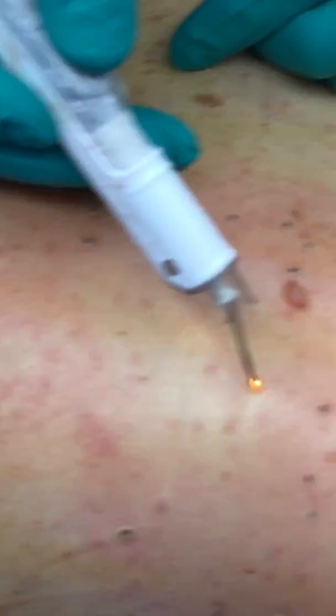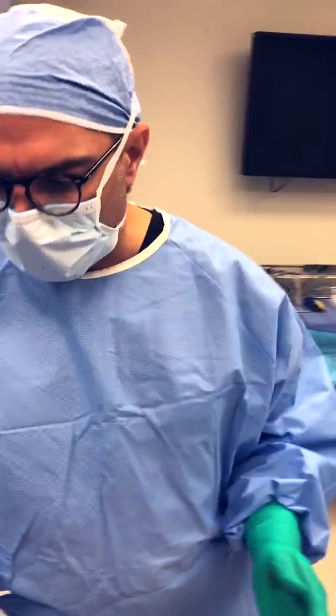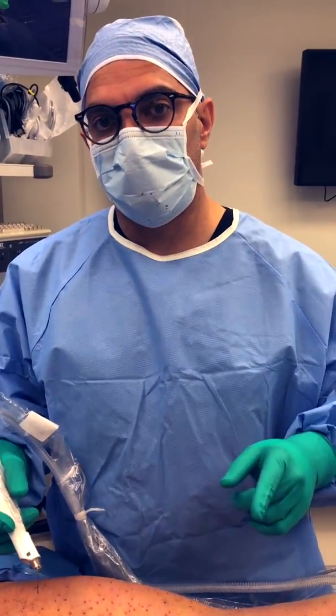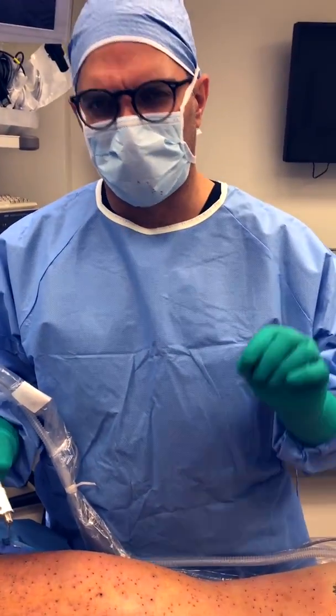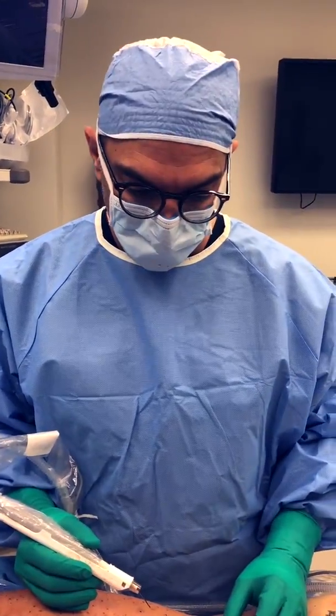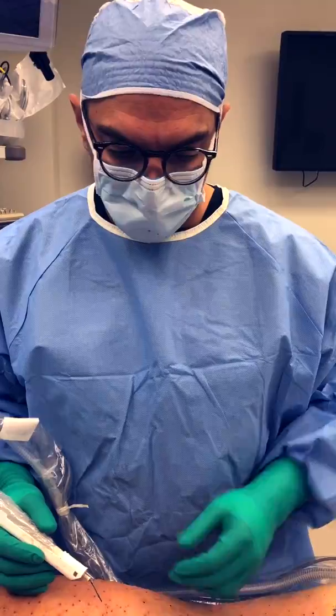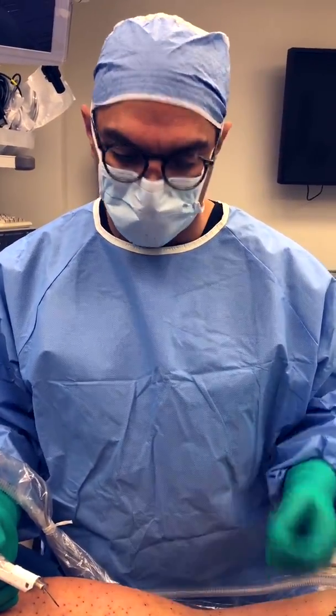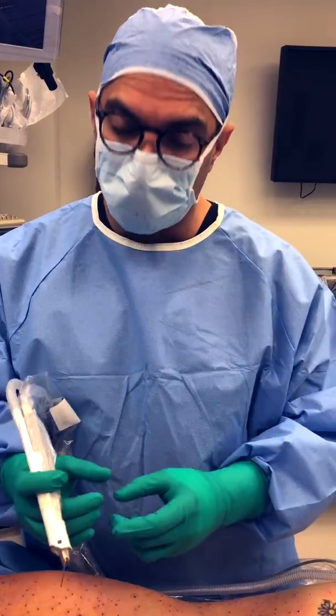We've completed the back for electro desiccation. Now I'm going to look at those few bumps I flagged before — I'll try the electro desiccation, see if it worked, and come back toward the end of the session to see if I need to remove them the traditional way, which is to excise or cut them out. In some cases I can just squeeze it out like a pimple.